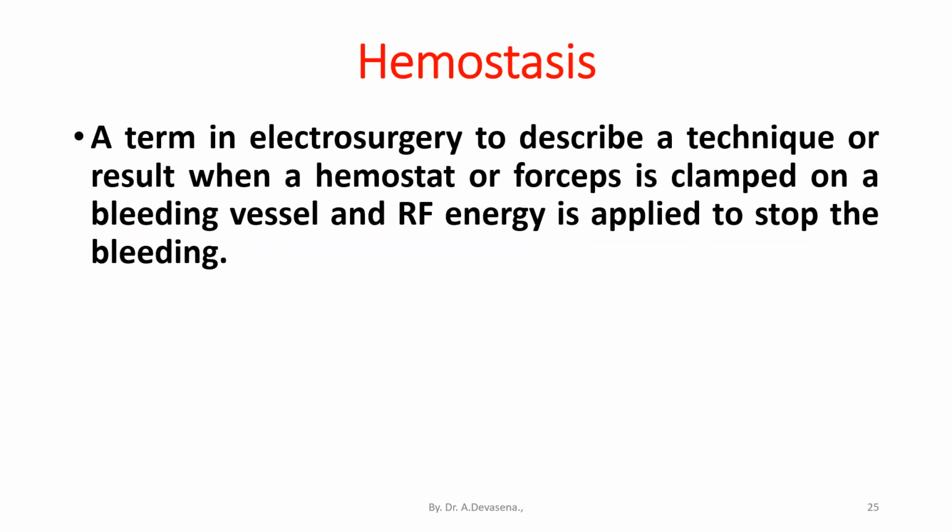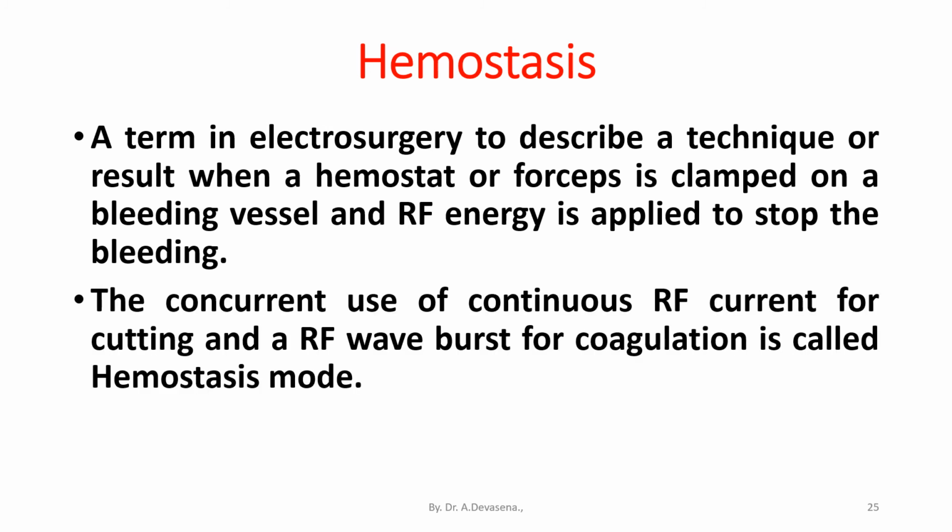Hemostasis, a term in electrosurgery to describe a technique or result when a hemostat or forceps is clamped on a bleeding vessel and RF energy is applied to stop the bleeding. The concurrent use of continuous RF current for cutting and a RF wave burst for coagulation is called hemostasis mode.